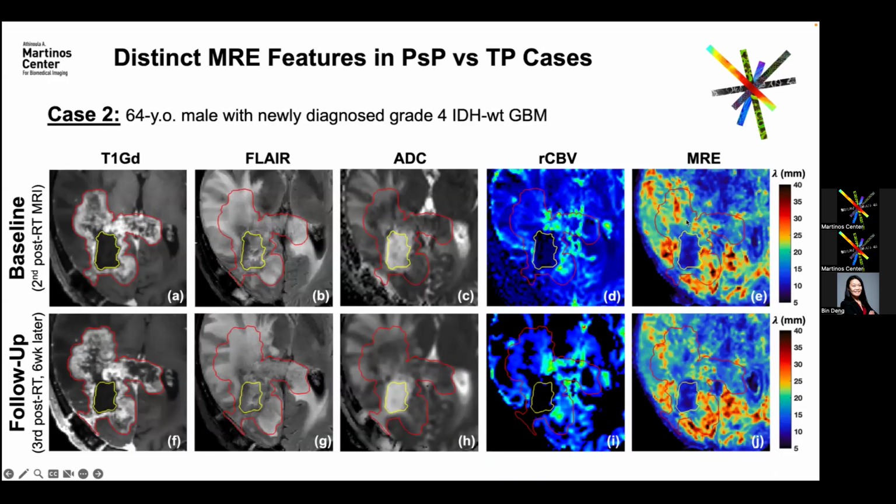And there are some necrosis changes, for example here, where it turns into necrosis on these images. I think the feature that interests me the most is here. You can see this high stiffness line aligned almost perfectly to the curvature just right outside the tumor.